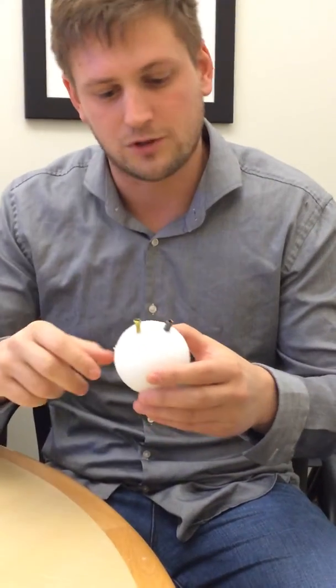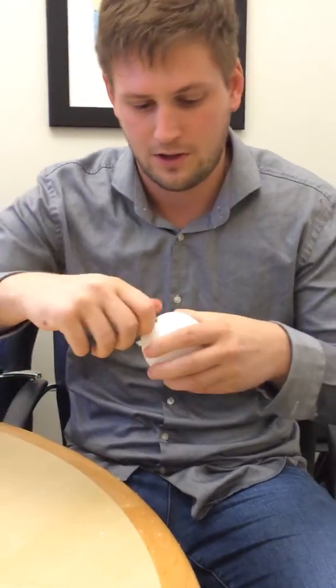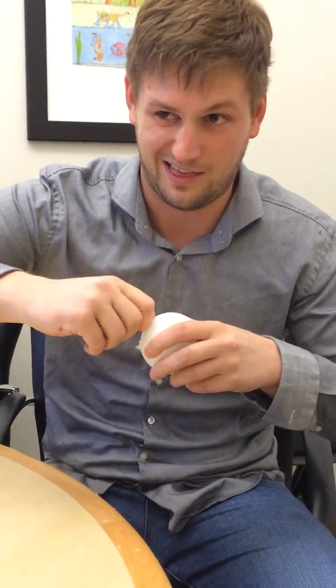If you put these in and have your surgeons try to pull them out, they'll be able to pull out the lag screw very easily, and it's really hard to pull out the AccuTrack two. You can actually do it if you grab pliers, but this thing is really — because it's fully threaded — able to hold on to all of this really soft bone.